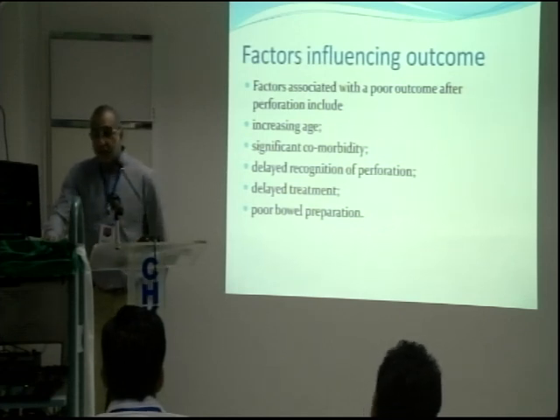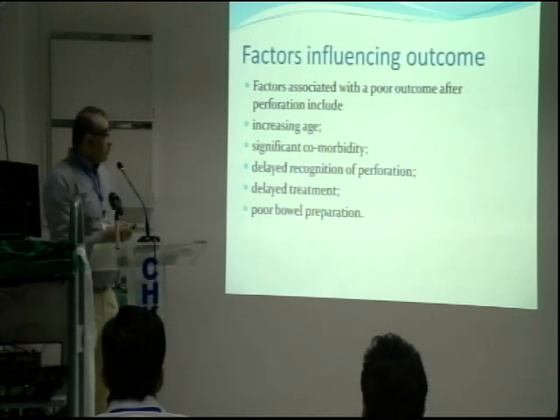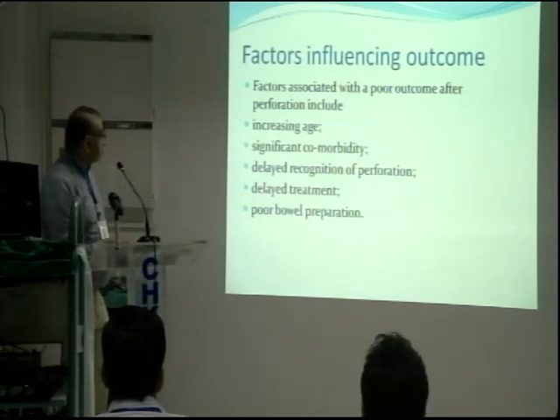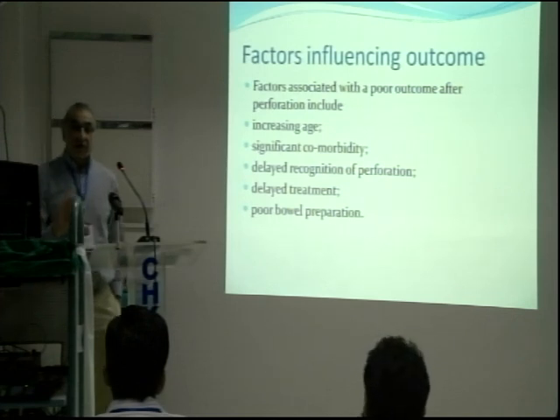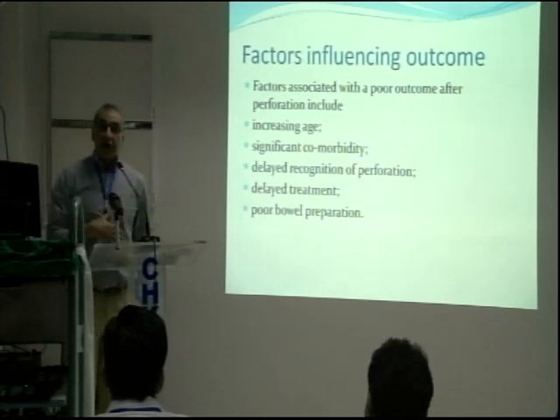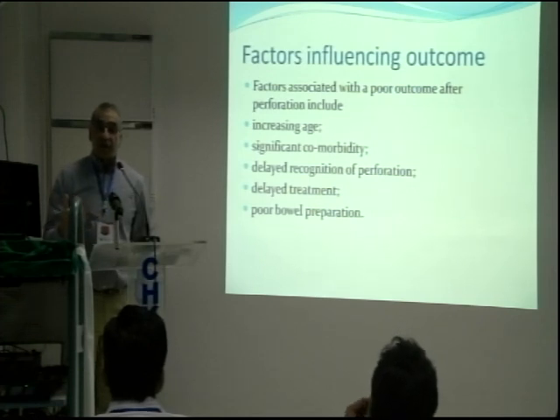Another important thing is, whenever you see a perforation, try not to hide it. Don't push it under the carpet. If you suspect a problem, you've carried out a procedure, and the patient is complaining of pain which is disproportionate to the degree of pain you would expect after the procedure, there must be something wrong. So always be proactive.